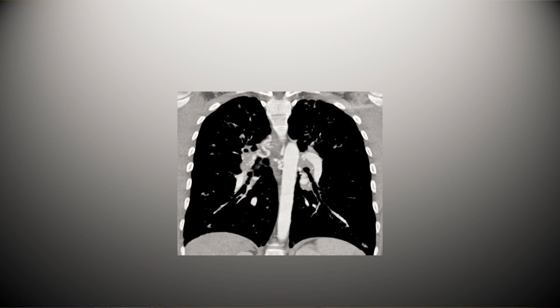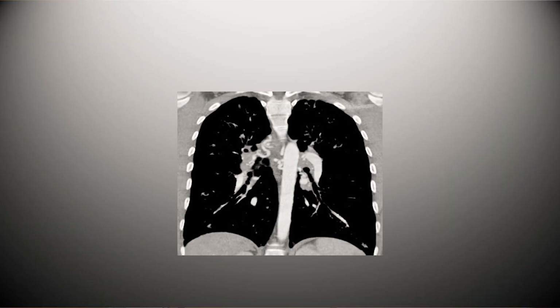And then the other thing we want to pay attention to, these are the mediastinal pictures. So lung pictures are just going to show you those alveolar opacities, nothing more than that. So it will just tell you the right side is bleeding or the left side is bleeding. If there is a tumor, very good. But what we want to look into are the mediastinal windows. So these are different windowing. Okay, so we are looking at the soft tissue, and what we are looking at are these big nodular or tubular shadows. So the bronchial artery will look something like this.